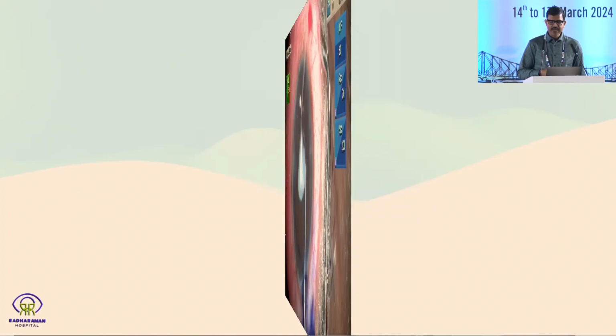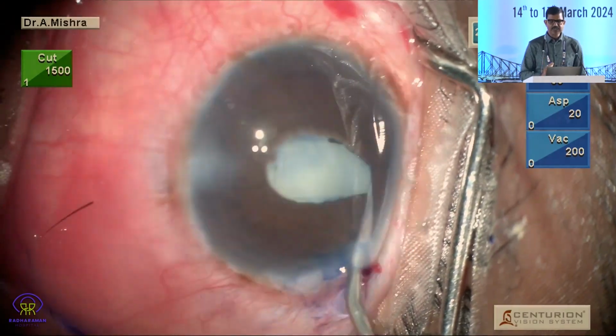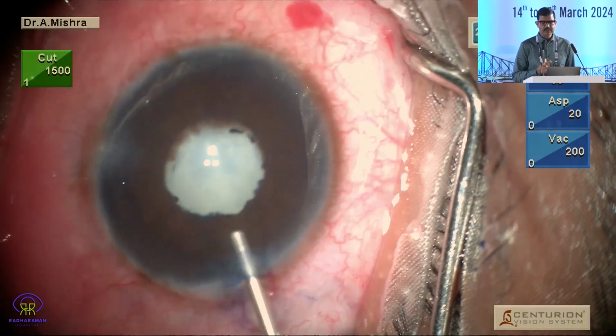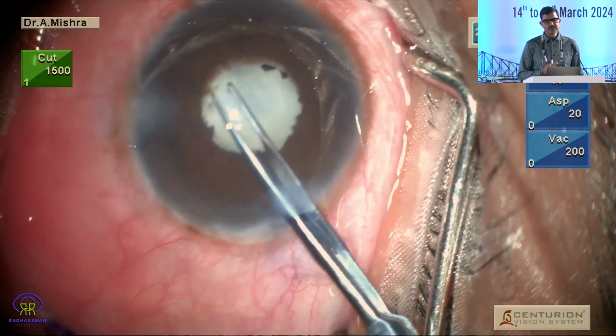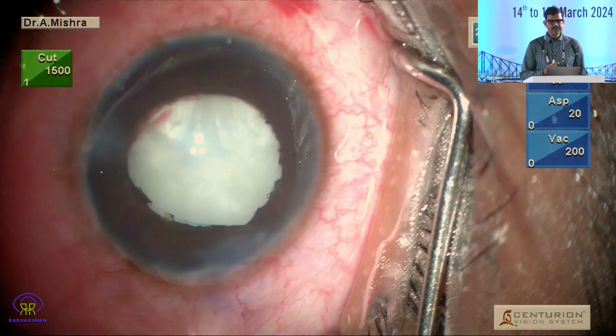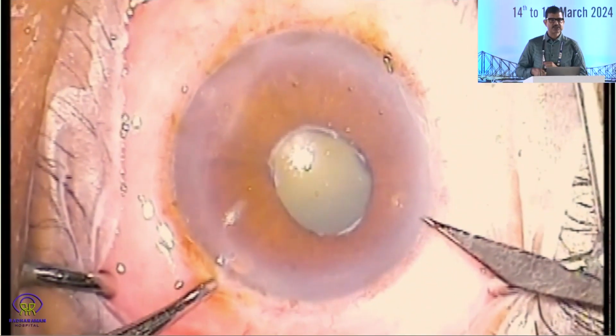At some other points, however, peeling the pupillary membrane actually causes very effective dilatation. You might not need any device after that. So this is one such case wherein the pupillary membrane was removed, peeled off from the margin, and look at the way it dilates after that. So the mechanical restraint, the moment it's removed, it dilates very well in certain cases. So we should always try to do that.